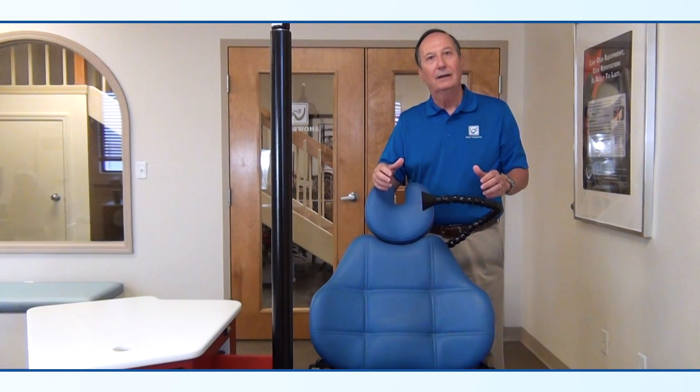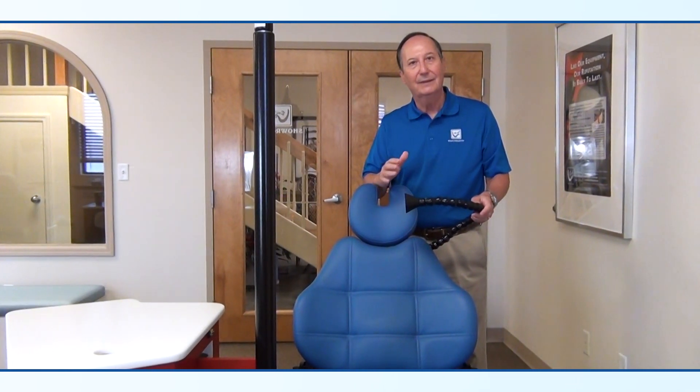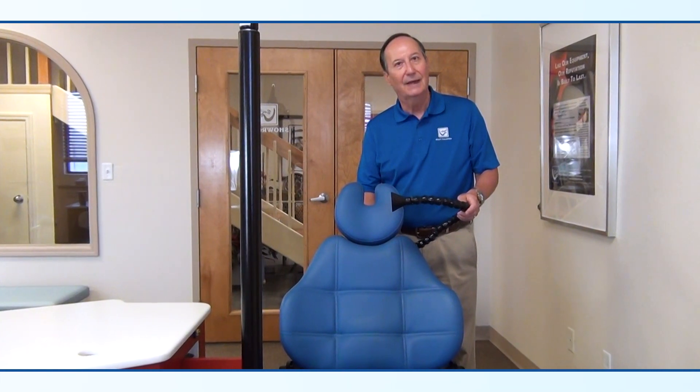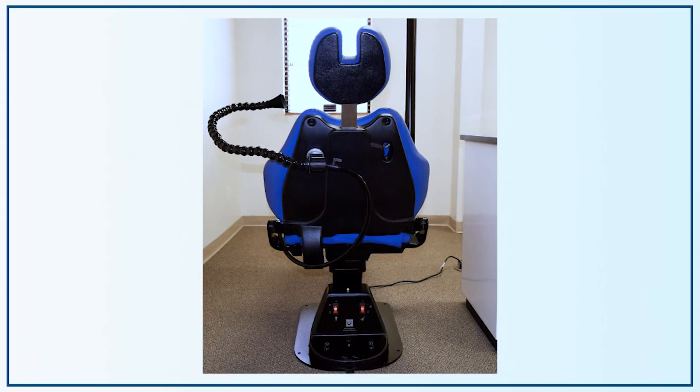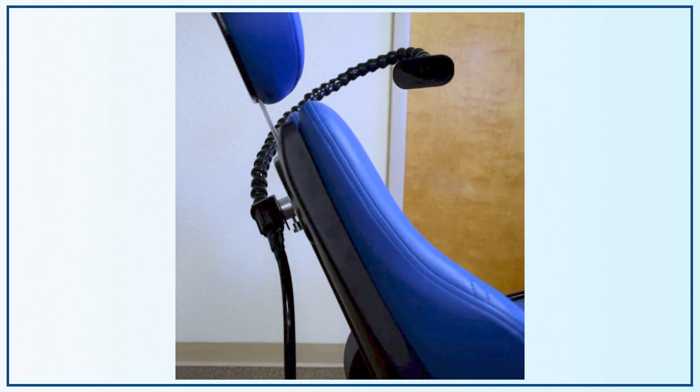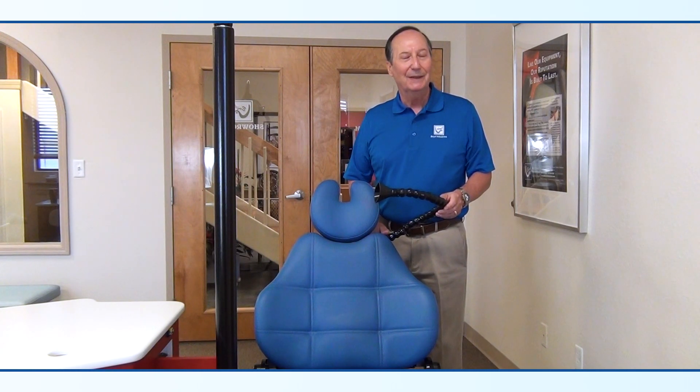The entire system comes with all hardware necessary to mount this to any chair. It mounts through the plastic backing of the chairs, utilizing a metal back plate so that it's secure once in location. The aerosol collector is made right here in our factory in Clearwater, Florida, and we can ship them out to you within two weeks of your order.